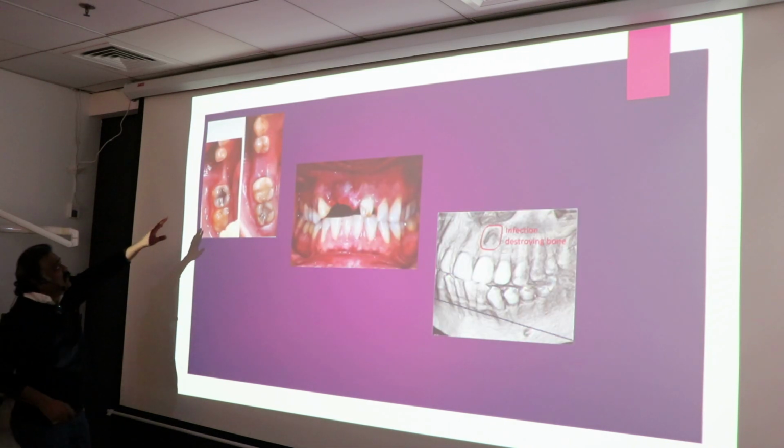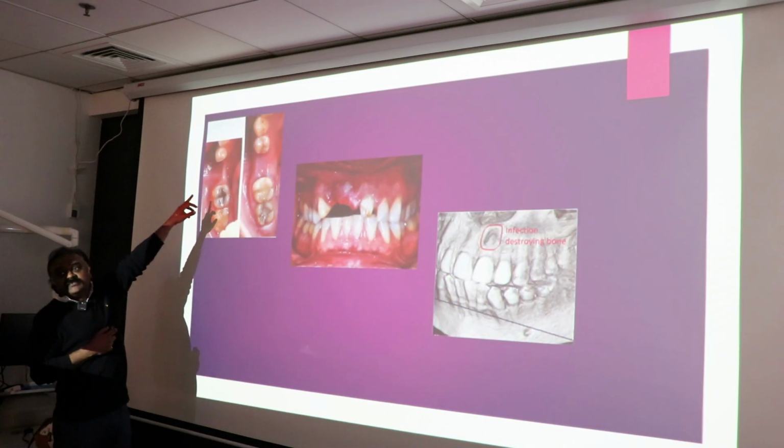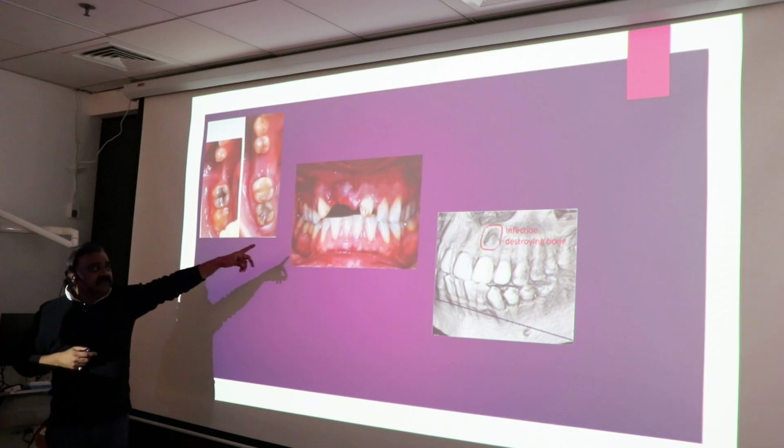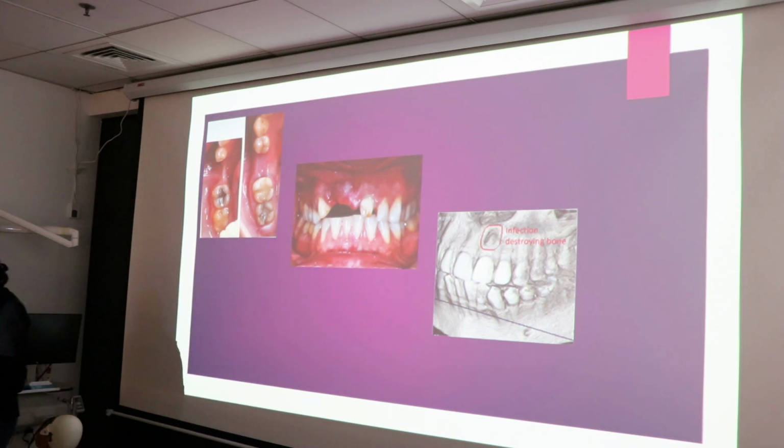See, look at the ridge here. So this is how mostly I get to see cases, because many people have not come for the replacement for a very long time. This should be ideal, but that's what you get. You have a periodontal infection there, or you have an infection which has been caused because of the endodontia. Now in all these situations you have to think in terms of getting the bone density and the volume right before you get to place an implant.